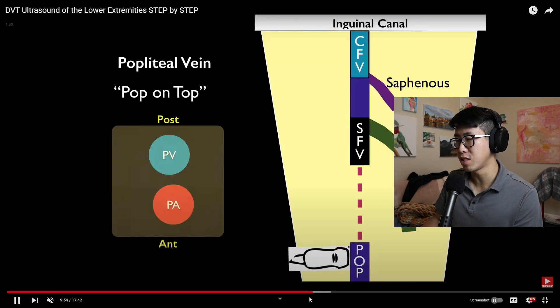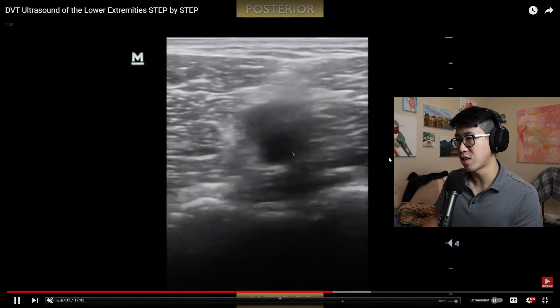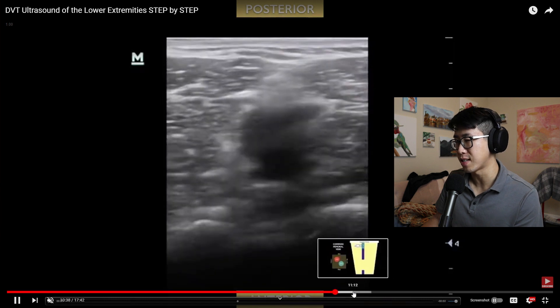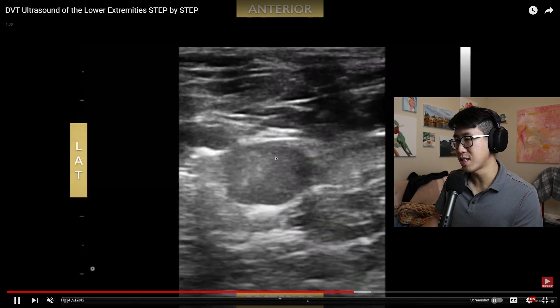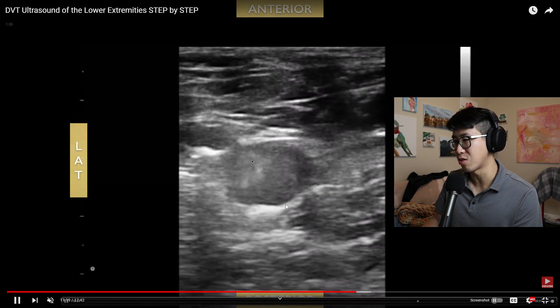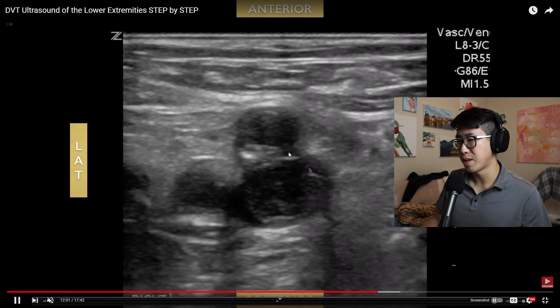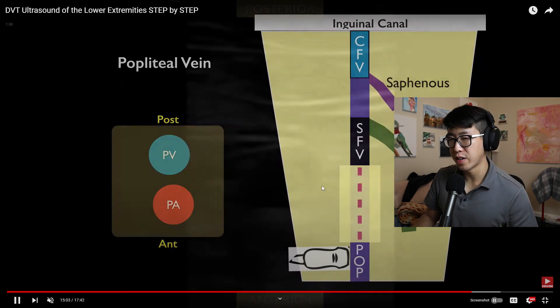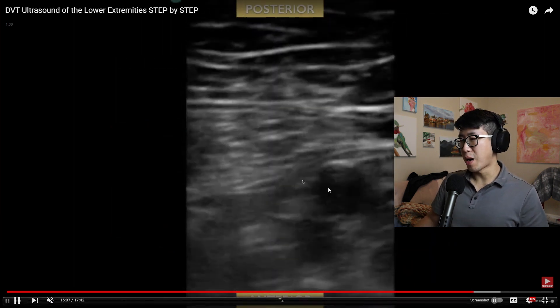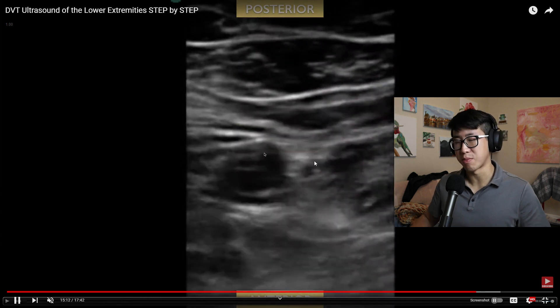Finally, you look at the popliteal vein — remember, pop on top. This is what a normal exam looks like: you compress, the popliteal artery stays patent, and the popliteal vein collapses. The video also shows abnormal findings: a clot in the middle, an example of the artery on top with a non-compressible vein on the bottom, and an abnormal popliteal example where the artery compresses but the popliteal vein does not compress at all.